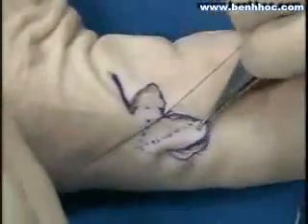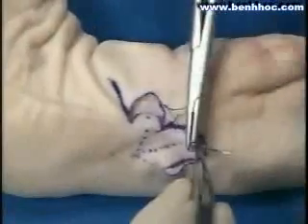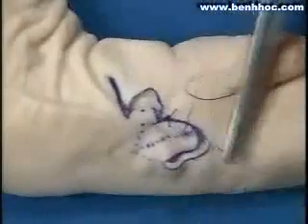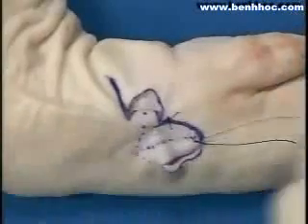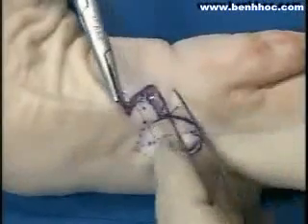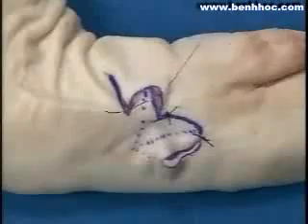Usually we use a two-handed tie for placing the first sutures in points of tension. Here's the suture being placed at the apex of this first flap, and that is being sewn into position. And now we can begin to see the flaps being rotated into position. Here we can see the second flap that's being rotated into position.